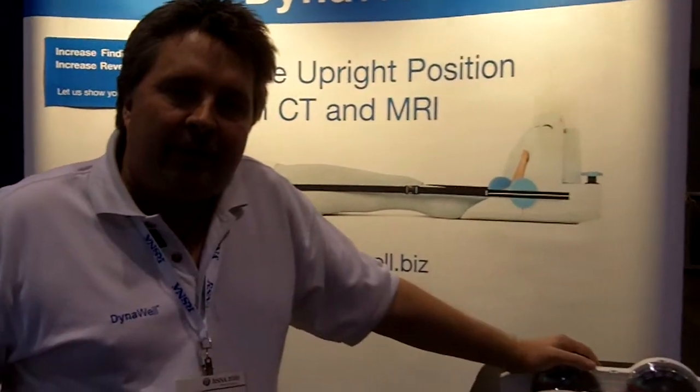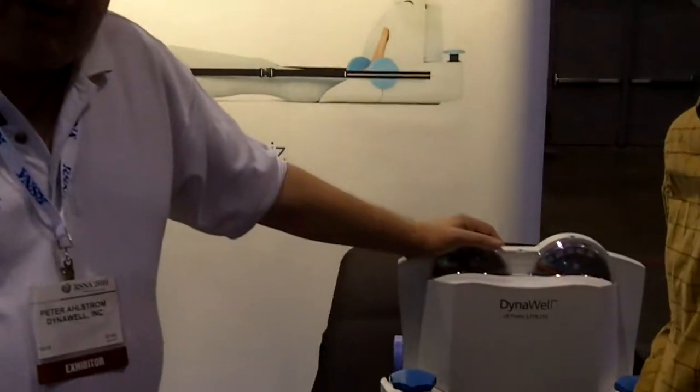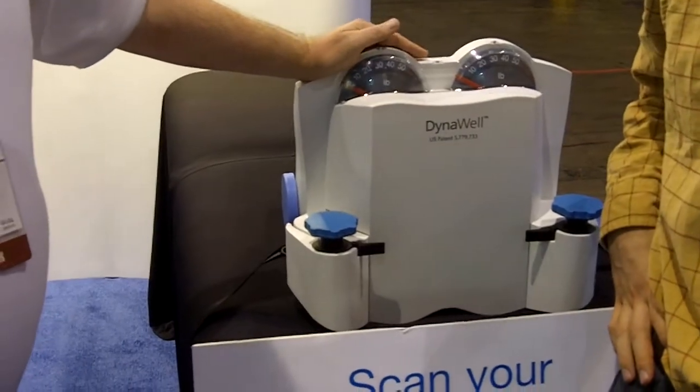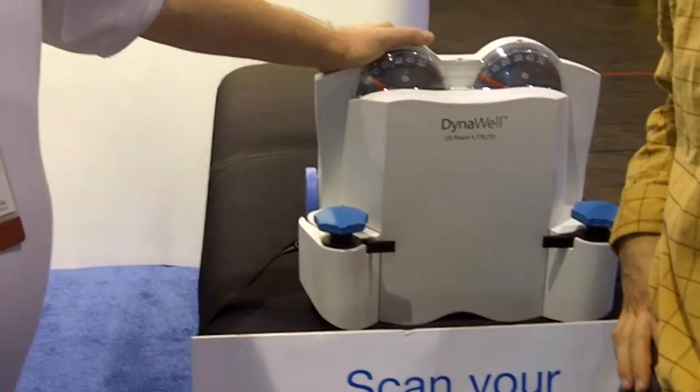What we have here we call the lumbar spine compression device. What this does is it adds gravity to a spine on a patient in a supine position. When the patient is laying down, you normally lose between 40 and 60 percent of valuable information due to the relaxed position of the spine.